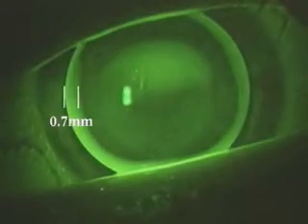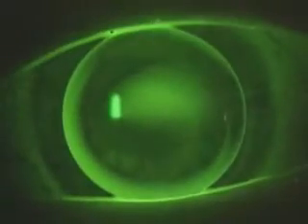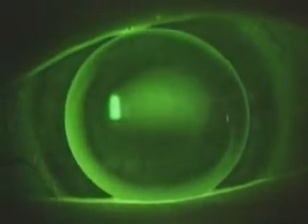The Rose K standard edge lift design will be acceptable for about 70% of eyes and produce a fluorescein edge width of 0.5 to 0.7 millimeters along the horizontal meridian. Due to unequal peripheral corneal flattening, the edge width may be very different in the nasal and temporal quadrants.